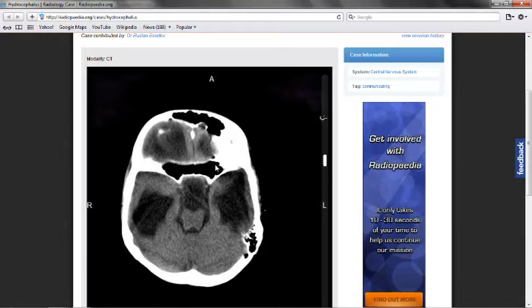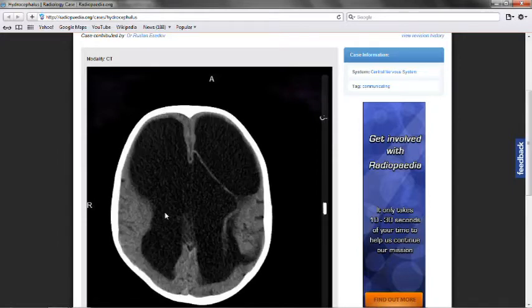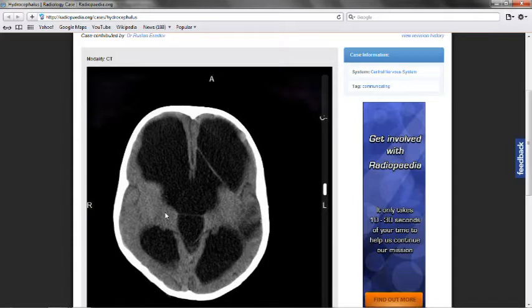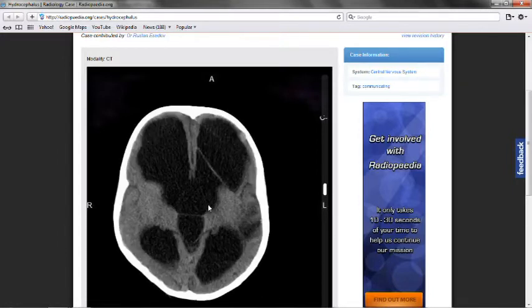Because it was seen here that due to the amount of brain matter that is actually just being absorbed and pushed out based on the size of these ventricles, how does this person normally function? And it would be very interesting to see, because you're looking at all of your motor areas, all your vocal areas, all of these things that make your body function being just completely obliterated.